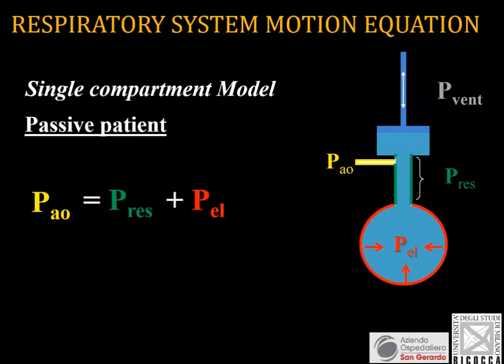There is so much to learn on the respiratory mechanics of the patient and on the disease of the patient by looking at the parameters we measure on the mechanical ventilator. So think of your ventilator not just as a tool to ventilate the patient, but as a tool to monitor the patient and to make a diagnosis on the patient.